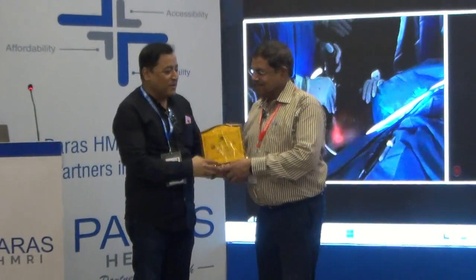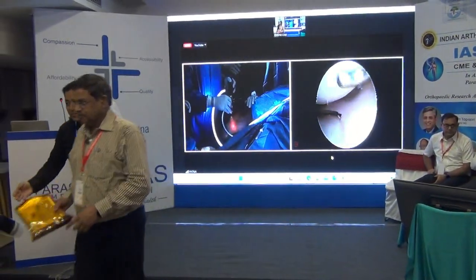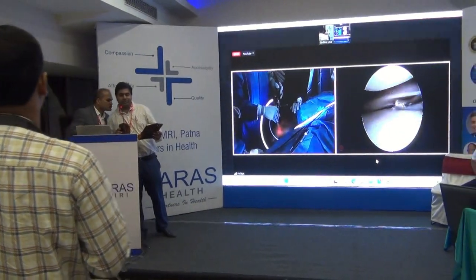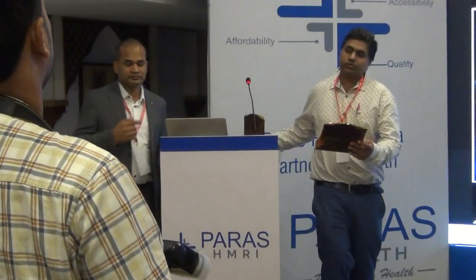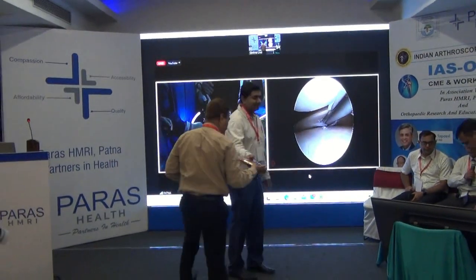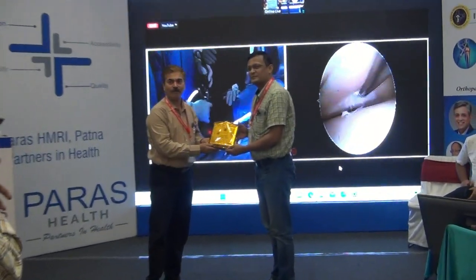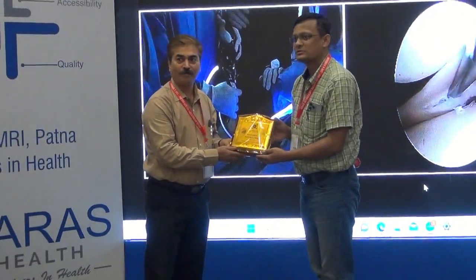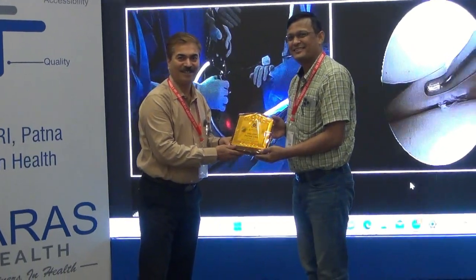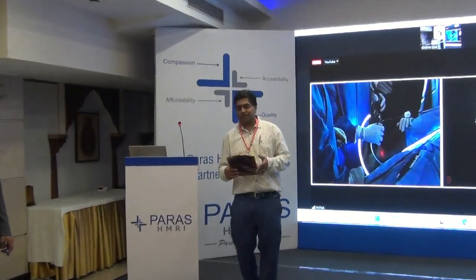Okay. So on the medial side, while probing, we found that there is an undersurface meniscal tear. So what we have done is pie-crusting so that we can open up the medial compartment, and you can appreciate this is the tear. Can you appreciate? Yes, sir. So there is an undersurface tear, a very small tear. But it has got some mobility. There is some mobility, so these undersurface tears might over a period of time convert into full thickness. So we'll just be stabilizing it with two all-inside devices. So this is the plan for the medial side.